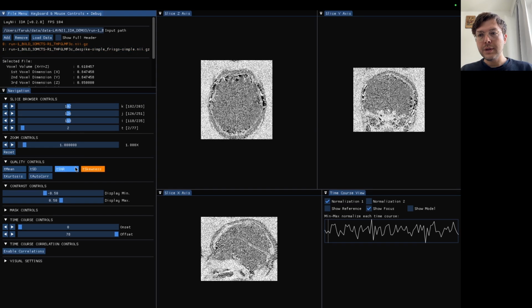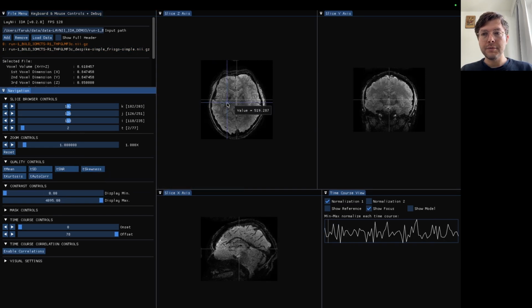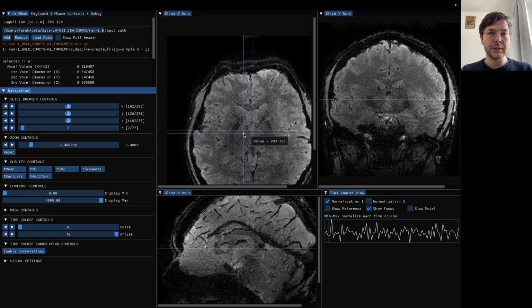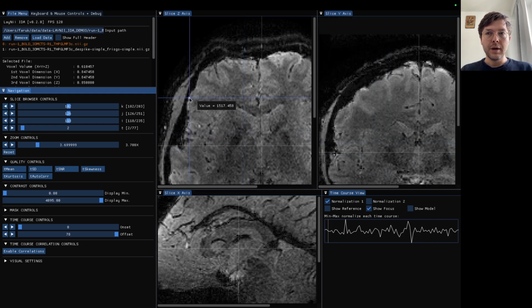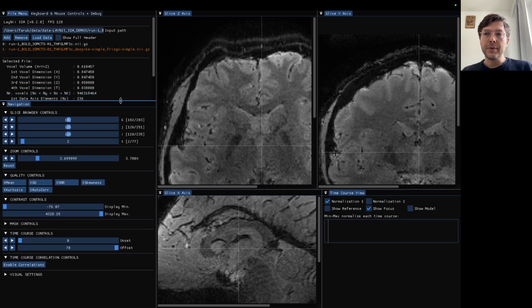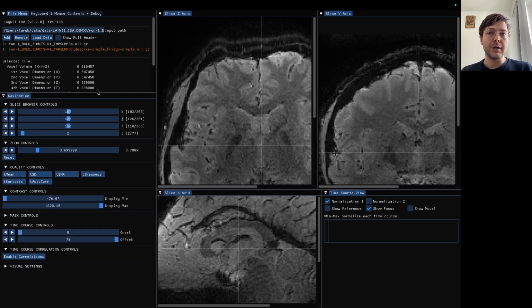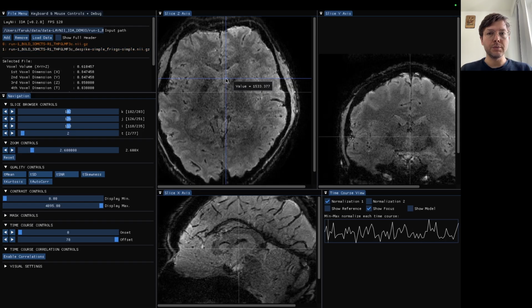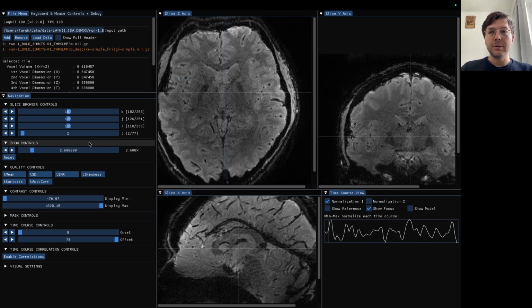Okay, here, what we can do in the new LayNii IDA version is that if I disable the quality control tools, and pay attention that I am moving this slice around, zooming in a bit, and now I can just switch to the second run. You can see that the visual is perfectly synchronized. And this will be the case whenever you load a data set that has the same dimensions, image dimensions, X, Y, Z dimensions, and T dimension. It will automatically synchronize where it is in the screen. So you can quickly switch between data sets and compare how they look.